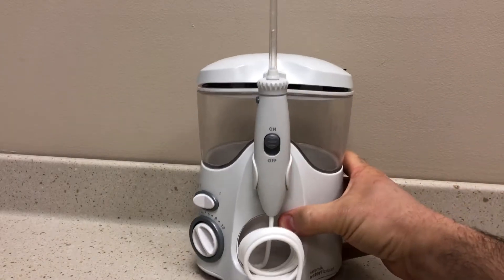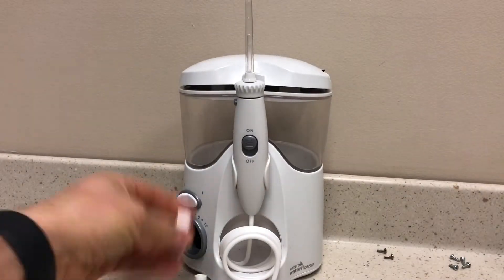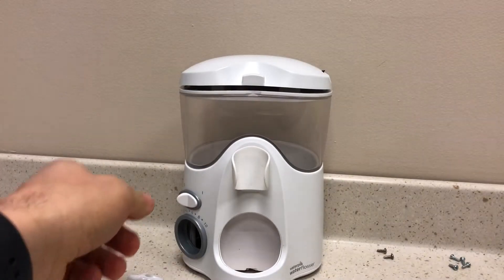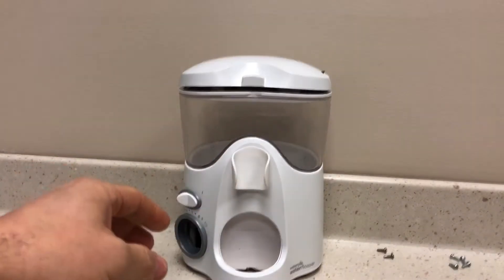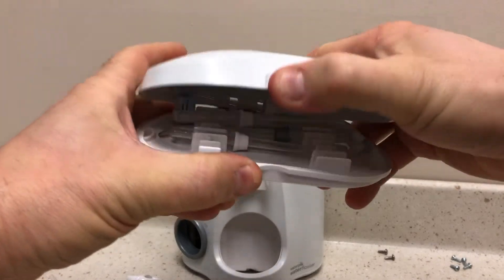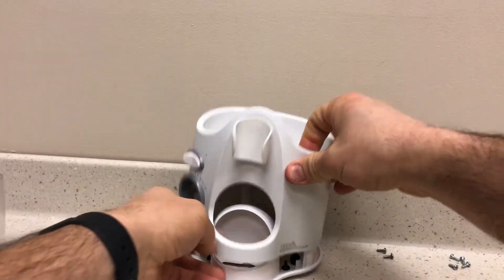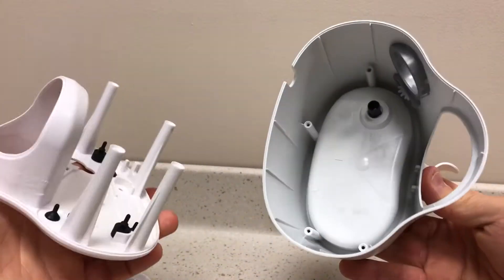Everybody, this is a relatively new water pick oral water flosser. I've taken the liberty of removing most of the stuff from this thing because it stopped working. We've got the guts of the water pick right here, which we're going to investigate in a moment. Basically this top comes off, it has a bunch of accessories inside, and the top water reservoir comes off. Then you can pry these two parts apart after removing a bunch of screws.